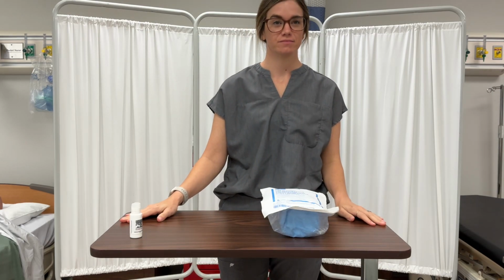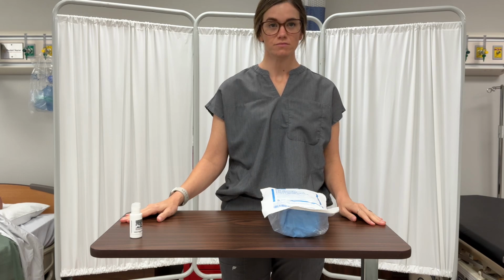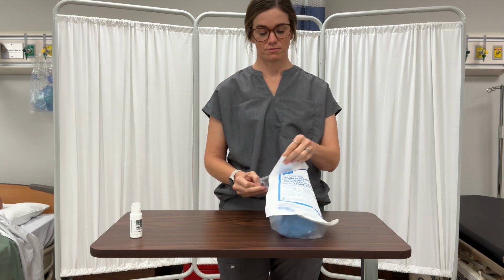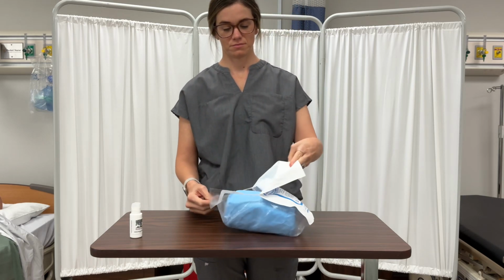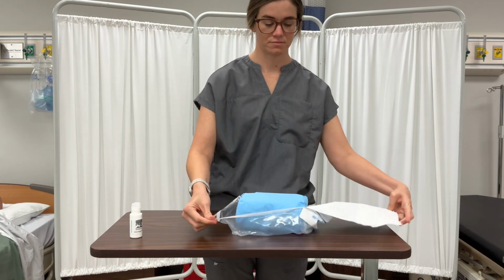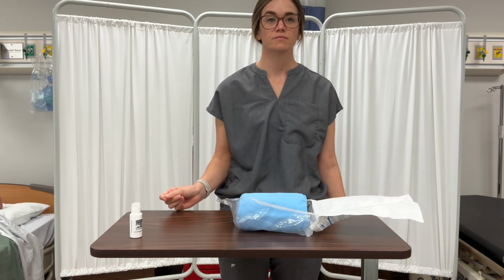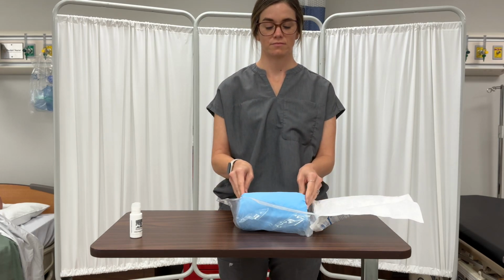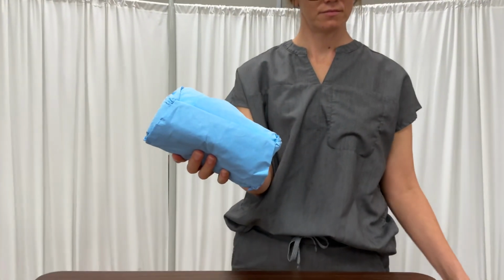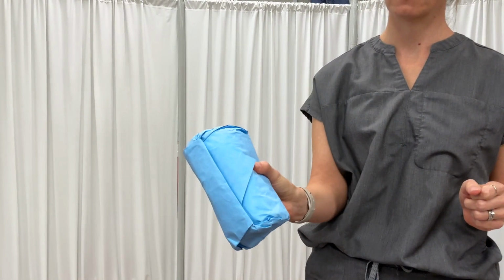Okay, guys, so now we're going to open a sterile package in your hand. You're going to open up the packaging from the outside. Okay, so you're going to place the package in your hand. We'll get close so that way you can see how she's holding the package. Okay, so can you turn it just a little bit so we can see? So she's got her thumb under that first flap.